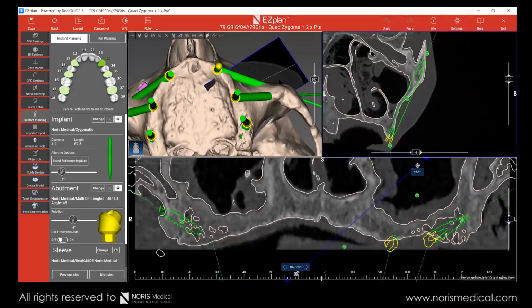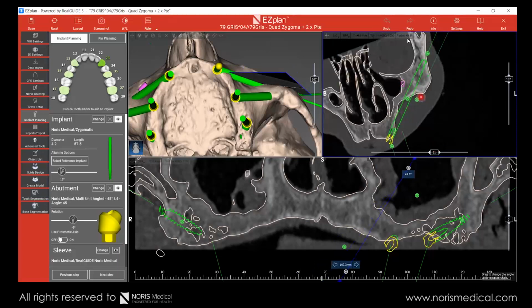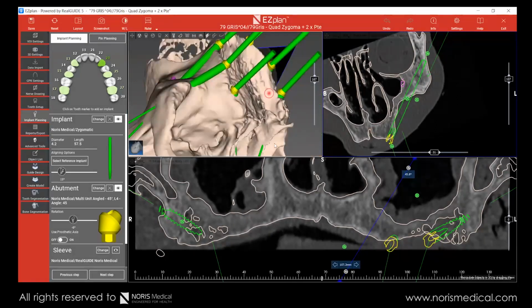This is what we see here. What we have on this plane is what we see here. Okay, so I'm rotating. What we see here, this is the orbita, and this is the ridge. Okay, this point is here. We're looking right now at this angle here.